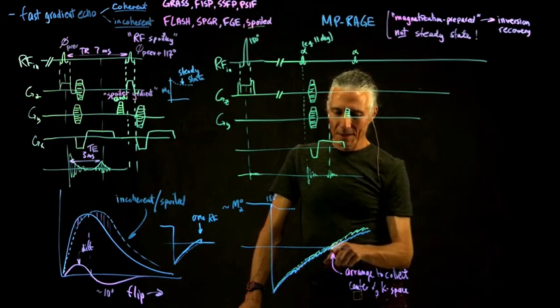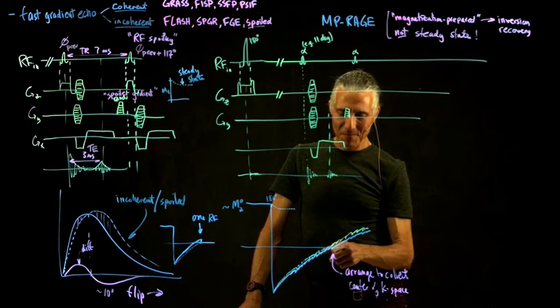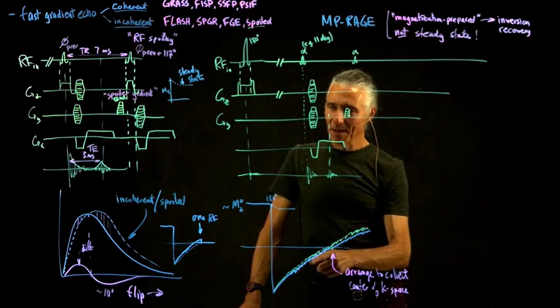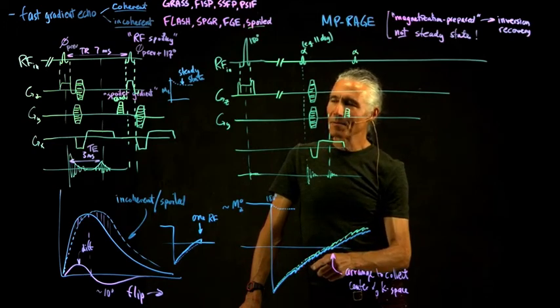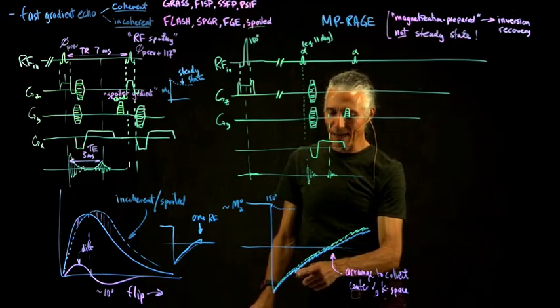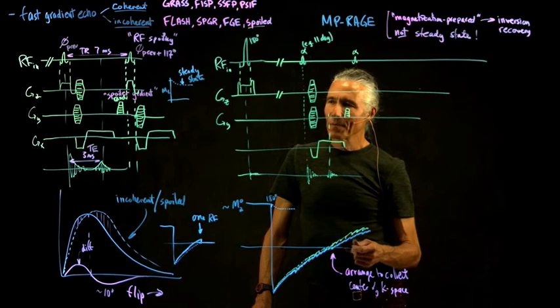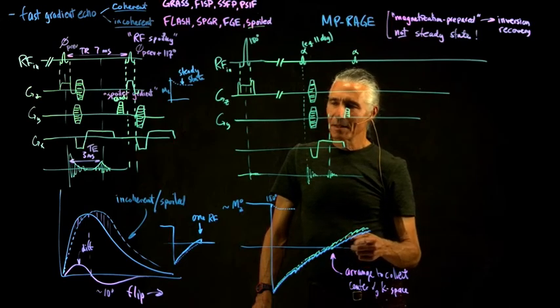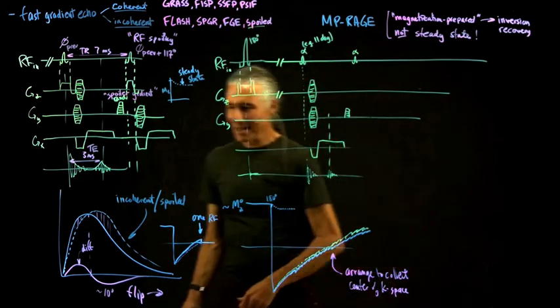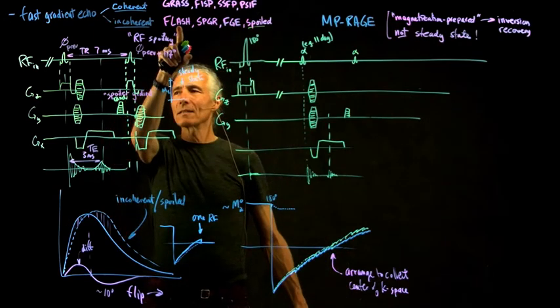So it will be essentially only one point in K-space that has this high contrast, and the other points in K-space are going to be recorded with differing amounts of gray-white contrast, different spatial frequencies. Remember, each one of these things is one line of K-space. So all these different spatial frequencies will have different amounts of gray-white contrast. But when you look at the final image, it looks pretty good, and a lot more contrasty than a standard FLASH scan.